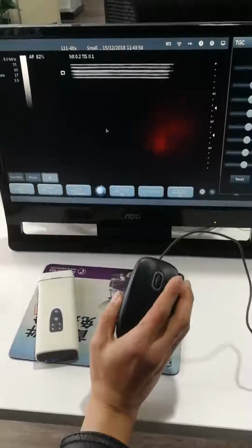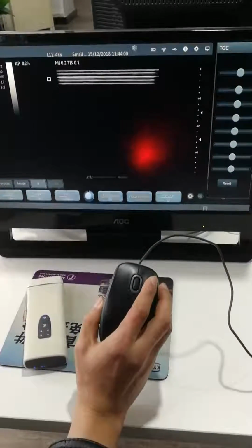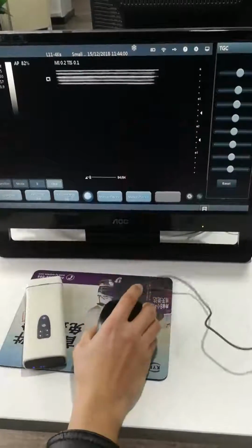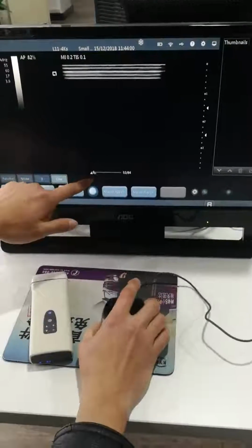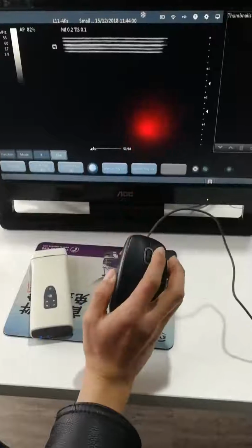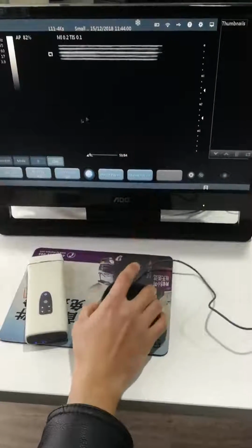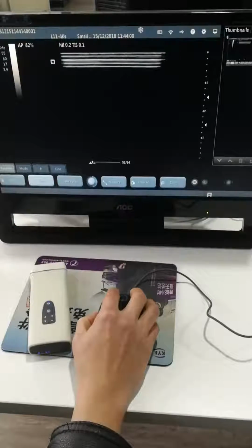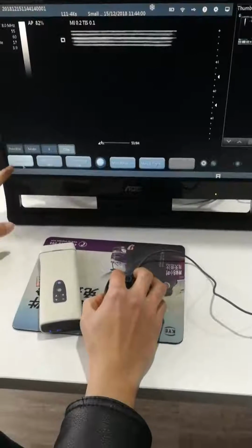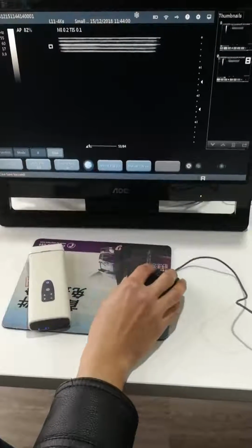And when you freeze it, you right click it and you can see the frame as you want, and you can save the cine or just save the image, and it will show here.